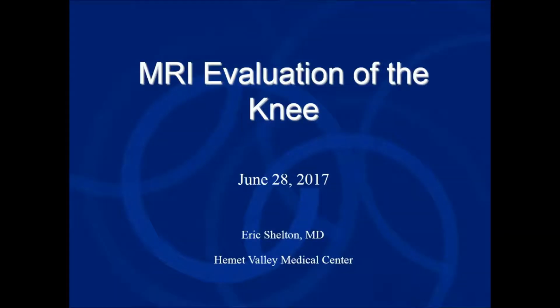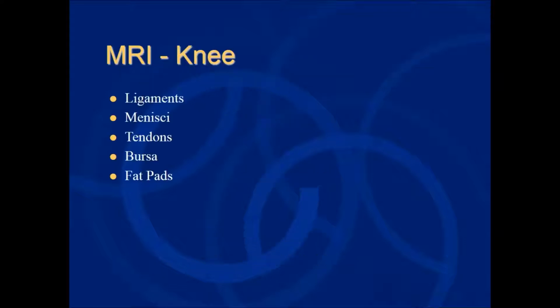Okay, this will be a general overview of MRI evaluation of the knee. This is by no means comprehensive and should definitely be used in conjunction with available textbooks as well as the large amount of resource material available online.